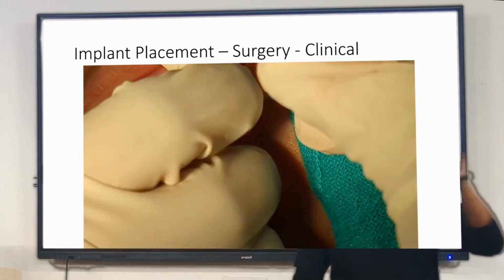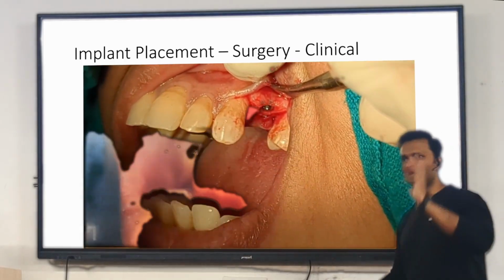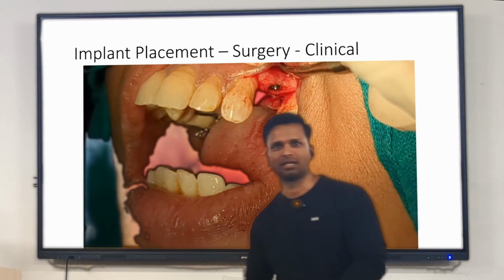Okay. The same thing I showed you can be done with a handpiece also. Okay. So you can do both things. You can place the implant by hand, or with a handpiece. The cover screw can also be placed by hand or with a handpiece.